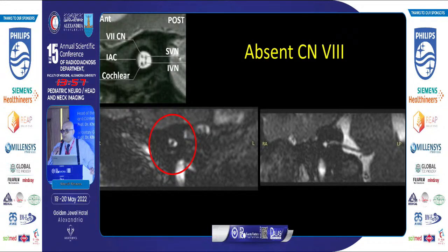In cases of vestibulocochlear nerve aplasia, we see a small-sized canal containing a single nerve — the facial nerve — with total vestibulocochlear nerve aplasia. Comparing normal anatomy with complete absence of the cochleovestibular nerve.